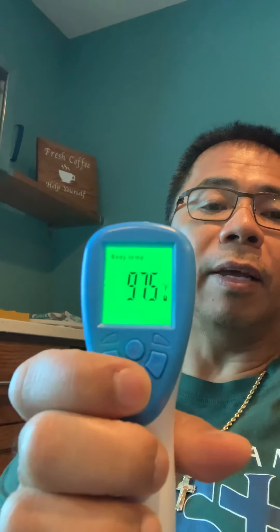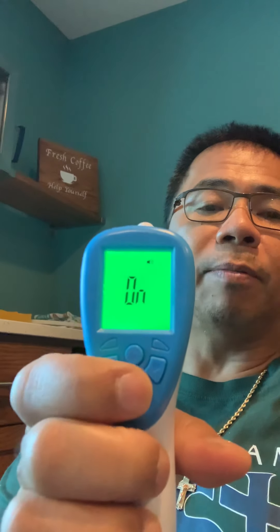I know most of us men don't read the instructions. There are a lot of different modes in the back — a mode button and an on/off switch in the back. Sometimes you press this one and that's an on/off switch as well. It is as simple as that.